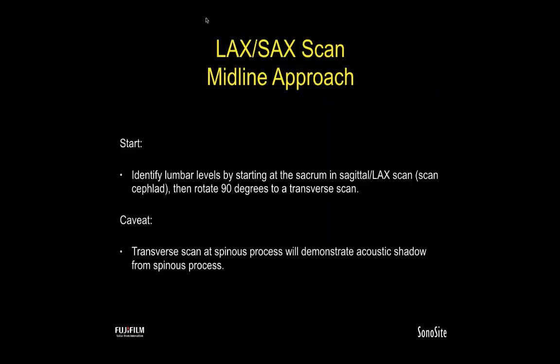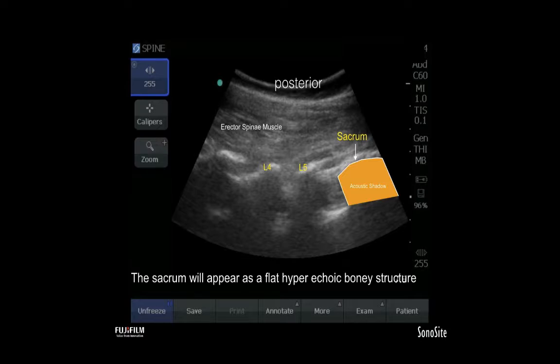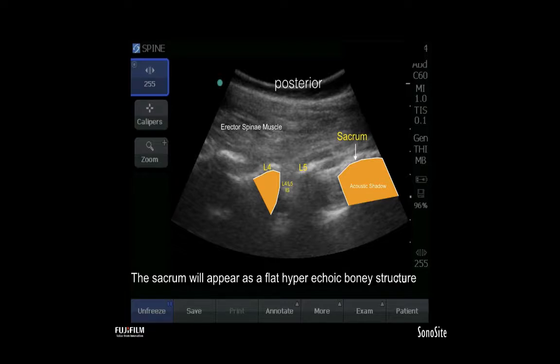When starting with either a long axis or short axis scan at the midline approach, if you want to identify lumbar levels, start at the sacrum in a sagittal or long axis scan and scan cephalad. If you want to go to the transverse scan, rotate 90 degrees. One caveat of the transverse scan is that at the spinous process, it will demonstrate an acoustic shadow from the bony process. In this slide, the sacrum is our starting point to count levels, next being L5, then L4. Any bone will produce an acoustic shadow due to attenuation of the beam. The L4-L5 interspinous space produces no shadow. Starting at the sacrum — which appears as a flat, hyperechoic bony structure — is a good place to start when counting up spaces and identifying the midline.